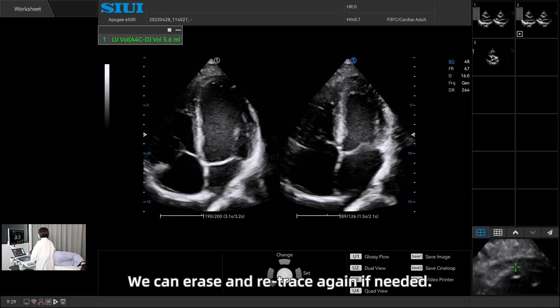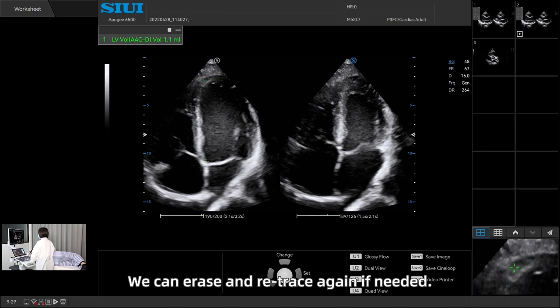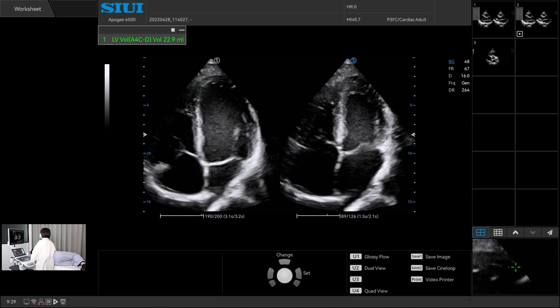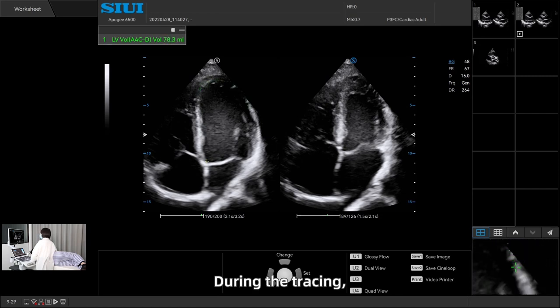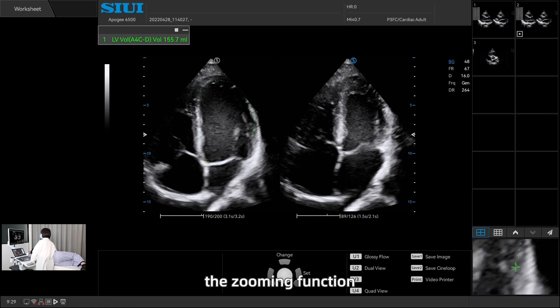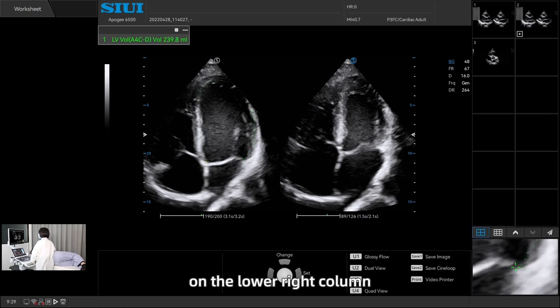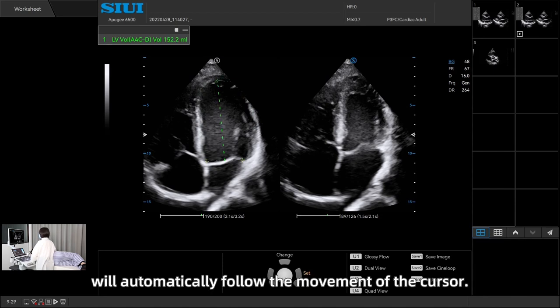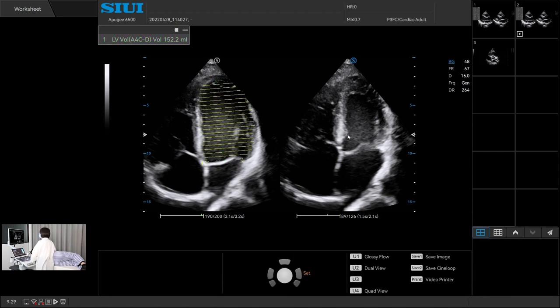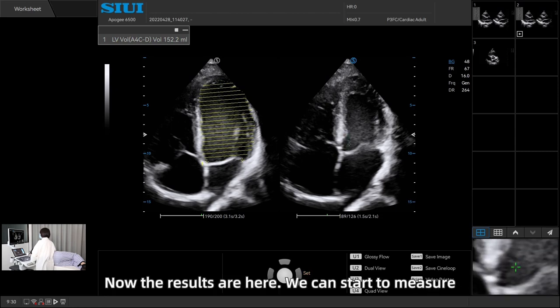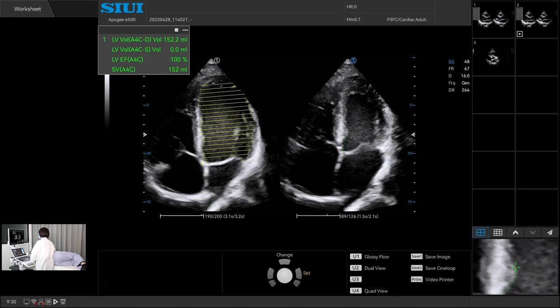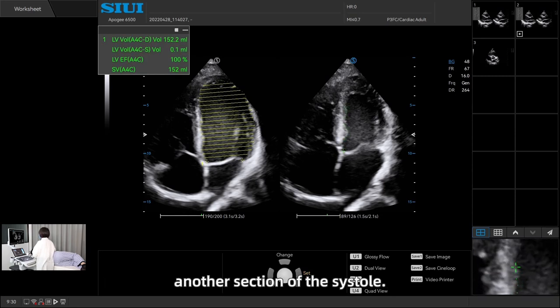We can erase and retrace again if needed. During the tracing, the zooming function on the lower right column will automatically follow the movement of the cursor. Now the results are here. We can start to measure another section of the systole.